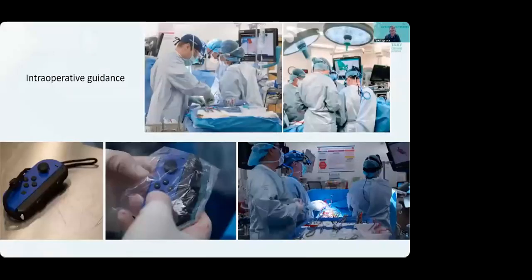We use the 3D models both before surgery as well as an intraoperative guidance tool, and we've reprogrammed several Nintendo Switch controllers, and we're able to manipulate the model from the field and the screen in front of us and achieve any combination of anatomical features and views, either inside or outside the heart, to help guide us as we do these operations.